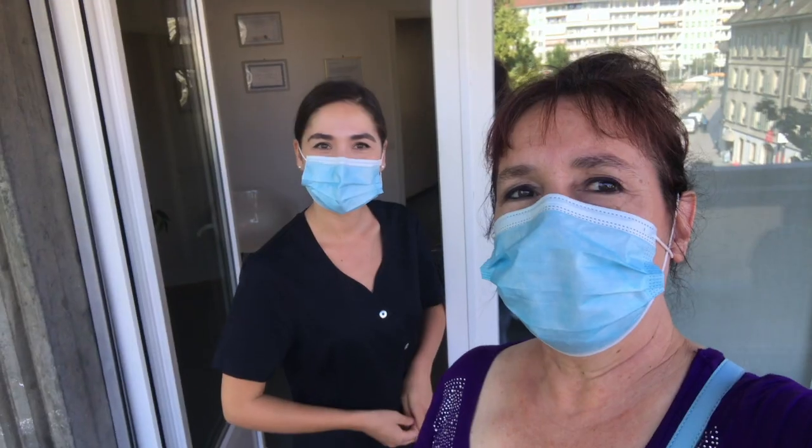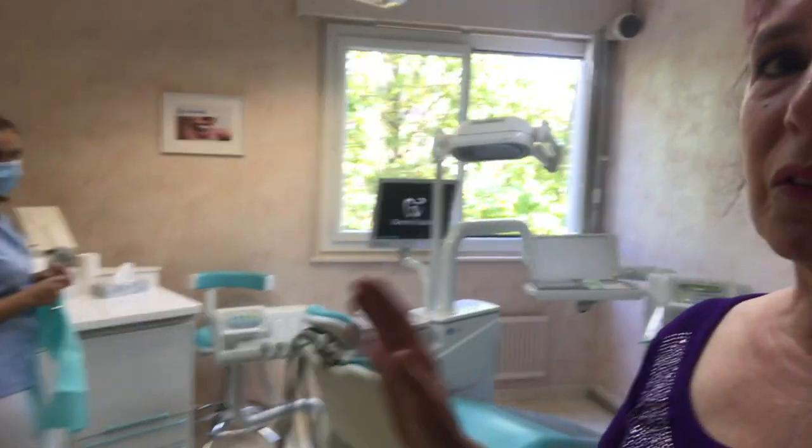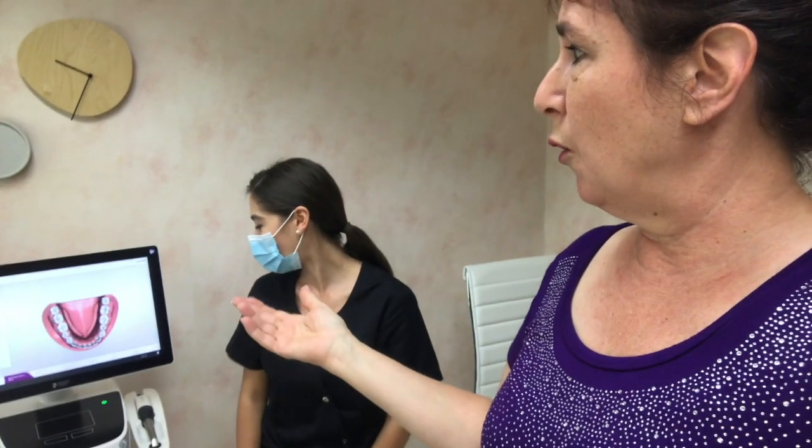Today I am going to get my teeth scanned instead of doing the old-fashioned mold. I'm at the orthodontist office now — they've got a really nice waiting room on the balcony. I'm here with Dr. Joanna Puescu. They've got this whole new system where she's going to be scanning each tooth and then we'll be able to watch it on the screen.